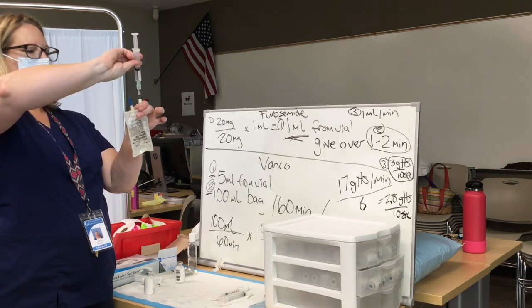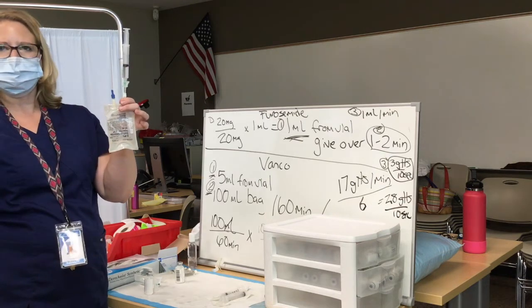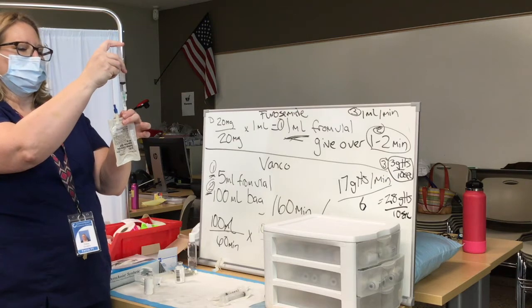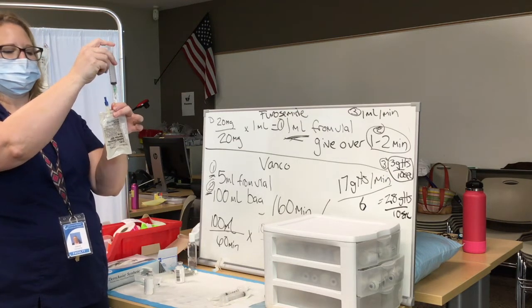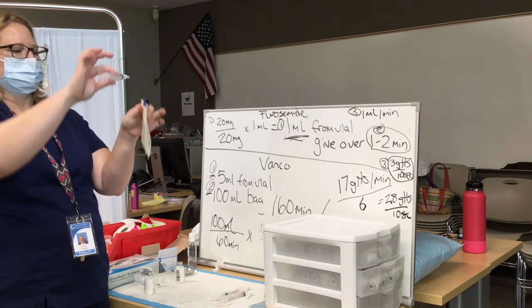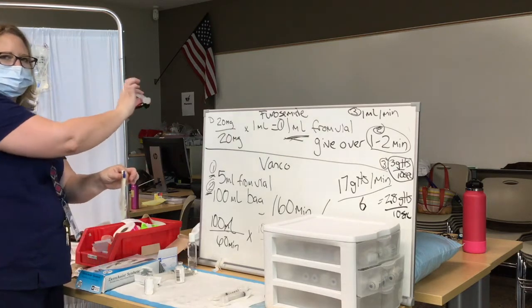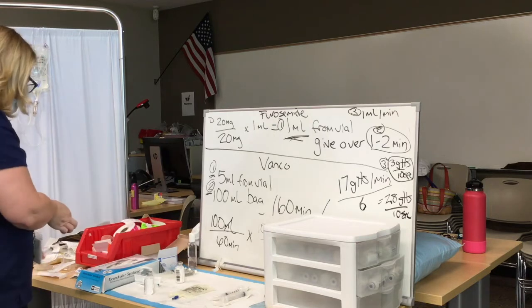Be careful not to puncture yourself. We do have some blunt needles here at the school that you may come across. I don't think the blunt needles will puncture through these bags, so the needles from the kit are the best ones to go in here. This can now go straight into your sharps container.